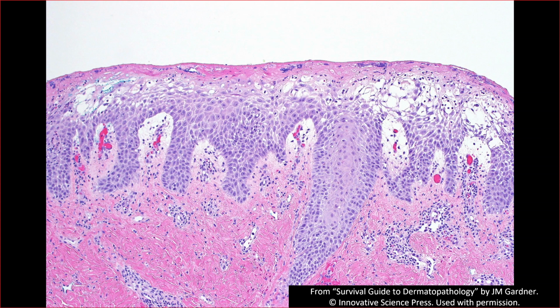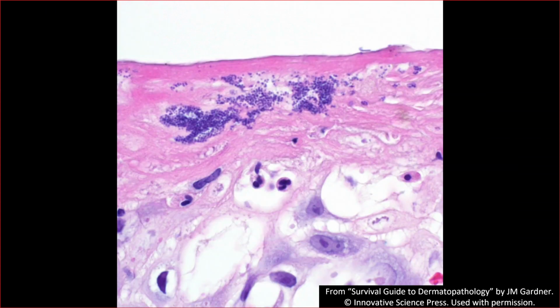And in the rare times I see a biopsy that looks like impetigo, because often it's recognized clinically and not biopsied, in those situations I will sometimes say, I'm not sure if the impetigo is the main thing or the spongiotic dermatitis is the main thing, and I leave that up to your clinical judgment. But since there's bacteria here, either way, you would probably want to provide topical treatment or a dilute bleach bath to get rid of the extra organisms. Because as you all know, even in eczematous dermatitis or other spongiotic dermatoses, if they're colonized by bacteria, it can make them harder to treat and more persistent.